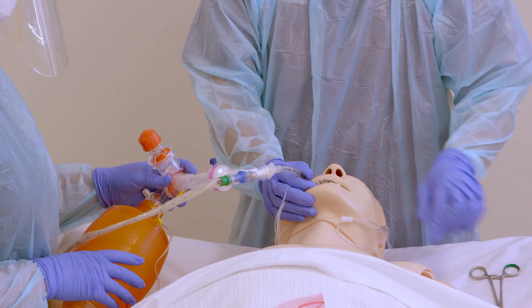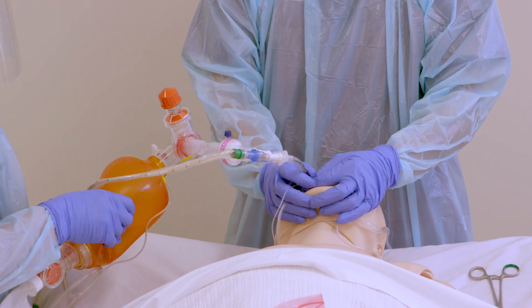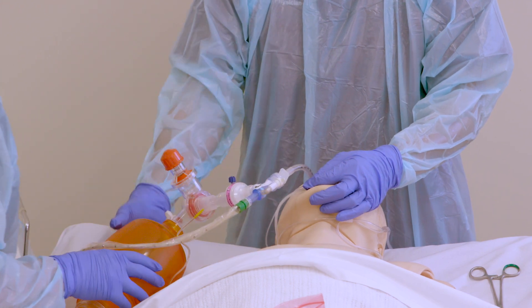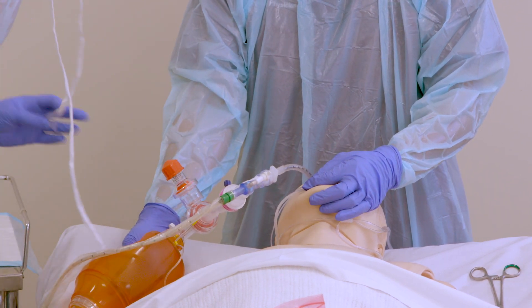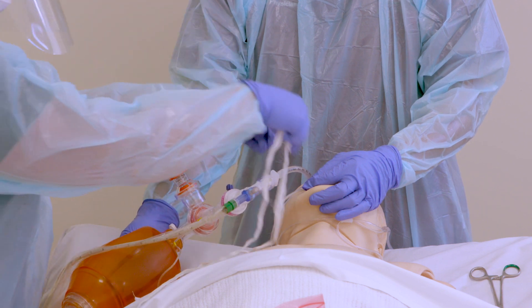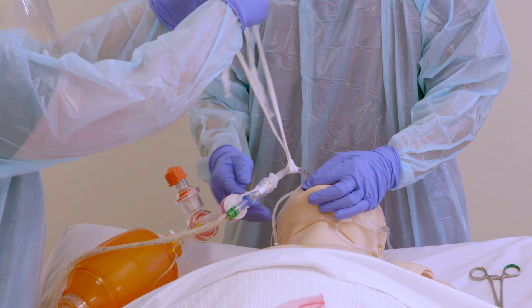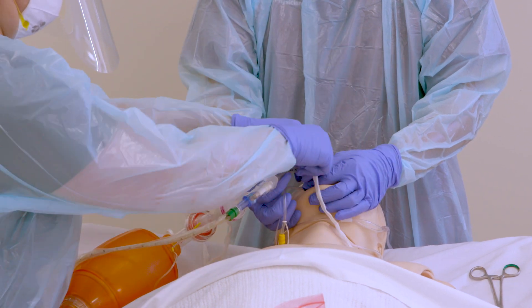Reapply the BVM with the viral filter attached to the ET tube. Unclamp the ET tube and gently squeeze the BVM. Secure the tube with ties. Do not auscultate for lung sounds to avoid close contact to the patient's airway. Check for equal chest rise and fall and end-tidal CO2 monitoring.